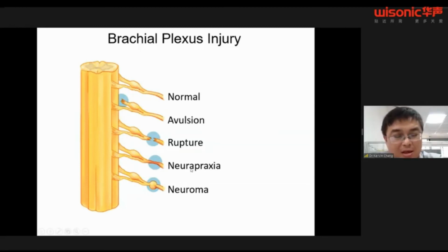For example, this case has breast cancer, and then she received radiation, and then 5 years later, she started to find that she had difficulty raising the shoulder. So in order to prevent the fibrosis from getting worse, we use hydrodissection to relieve the adhesion every 2 weeks.